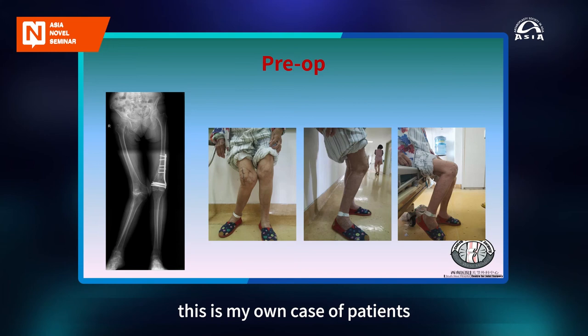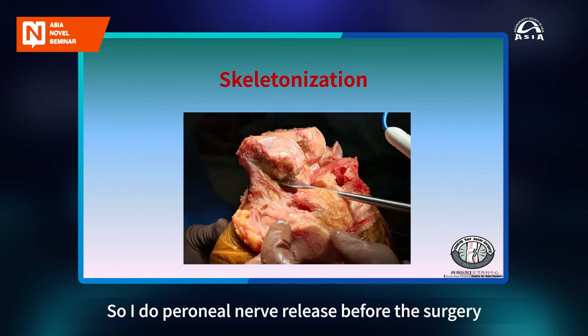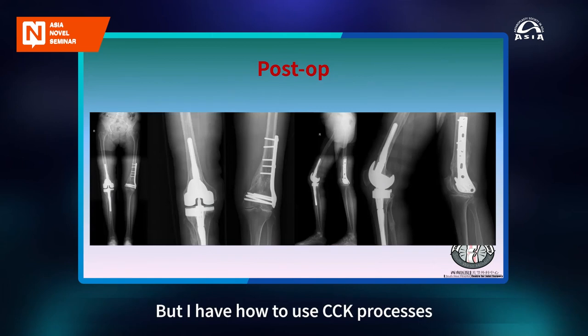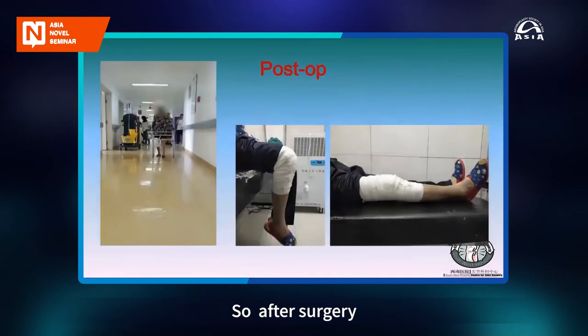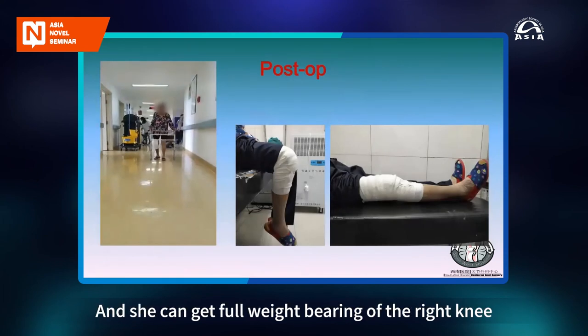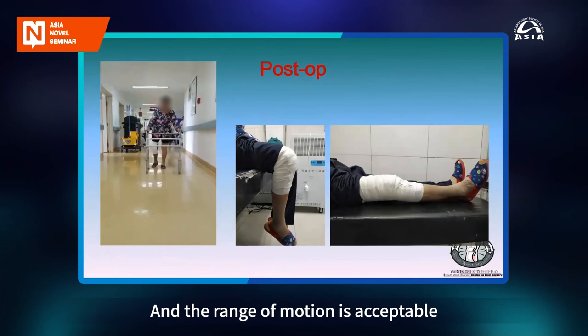This is my own case of a patient with flexion deformity and valgus knee. I do a peroneal nerve release before the surgery, before the bone cut, and I do lateral condylar skeletonization. But I have to use a CCK prosthesis to keep the stability. After surgery, the patient can get full extension, and she can get full weight bearing of the right knee, and the range of motion is acceptable.